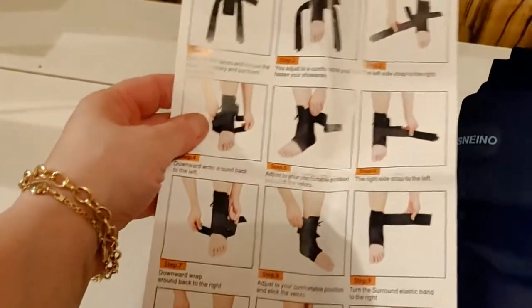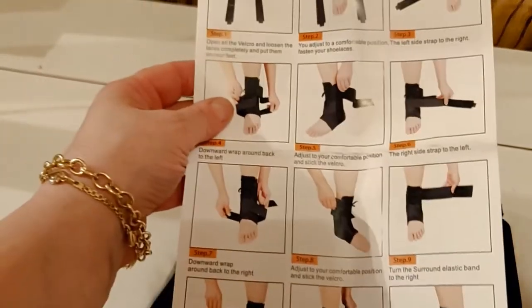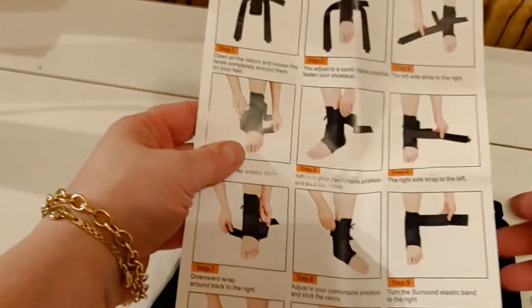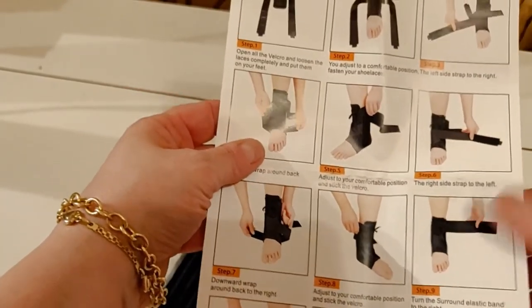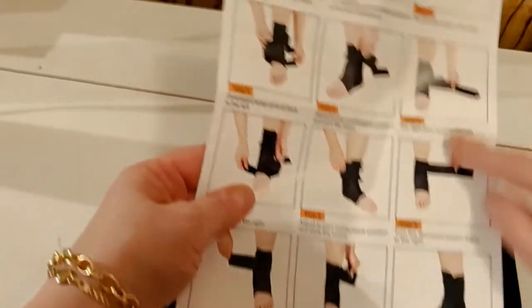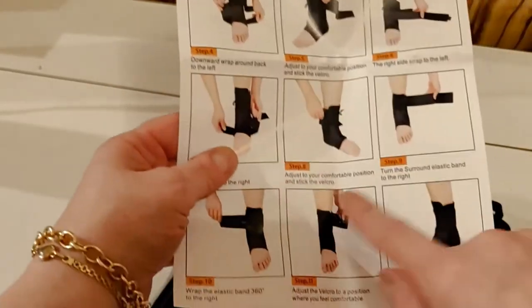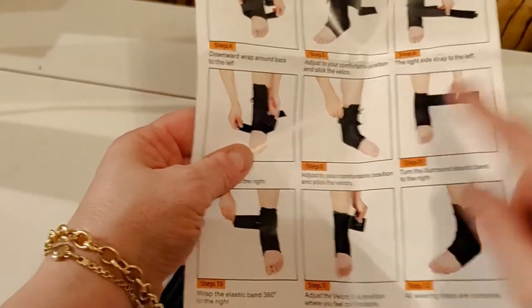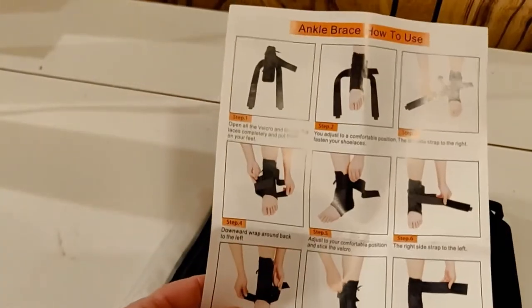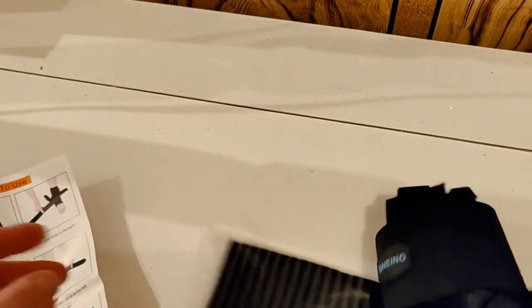So then I did a little search on Amazon and I found the Snenyo. The thing I like about this one, it's got laces. I think the laces are going to help give me more support. It does come with directions because there are 12 steps to getting this done, and it looks a little bit difficult, but after a while you'll get it and it should be fairly easy to put on.